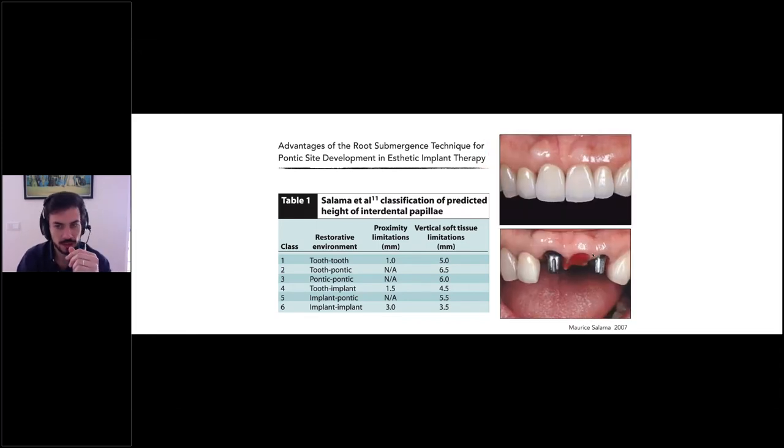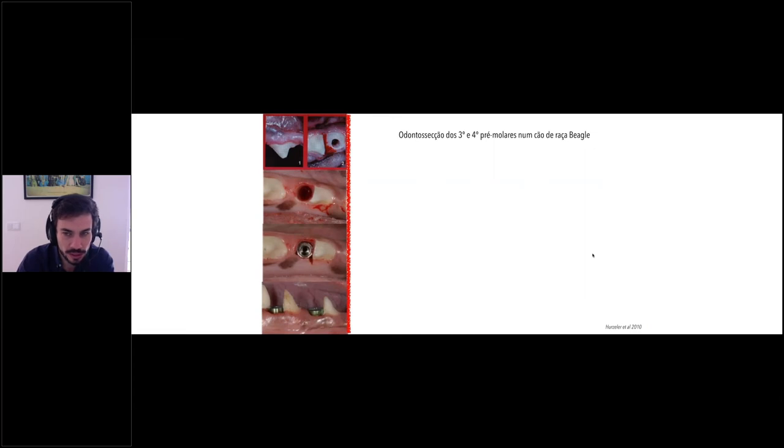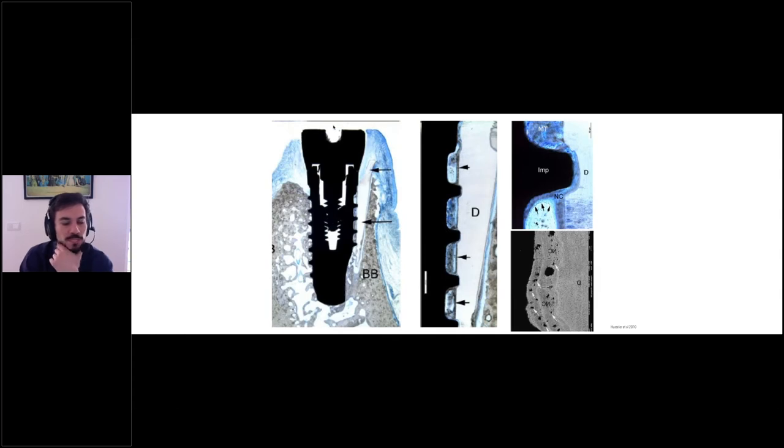Here you can see the article and you can see the beautiful pictures of these cases. In 2010, Hürzeler came with this proof of principle of the socket shield technique. This was an animal study, and they were studying beagles. They left the buccal part of the roots, then put the implants behind the roots, and after four months they made the histologic evaluation of the specimens. What they found is that the bundle bone was really preserved. They found new cementum and they found bone in contact with the threads of the implants.